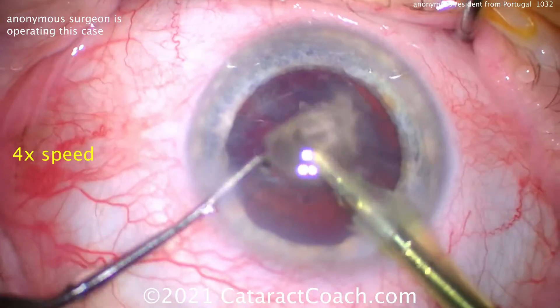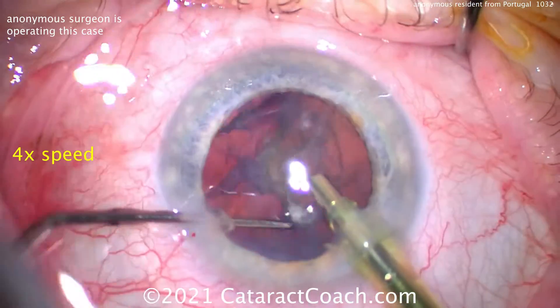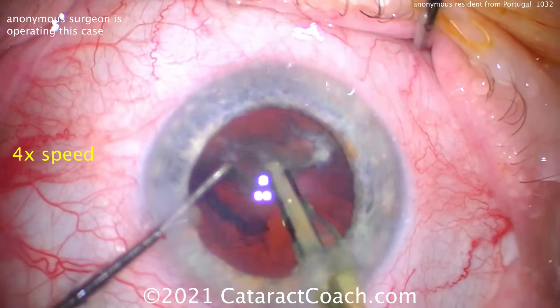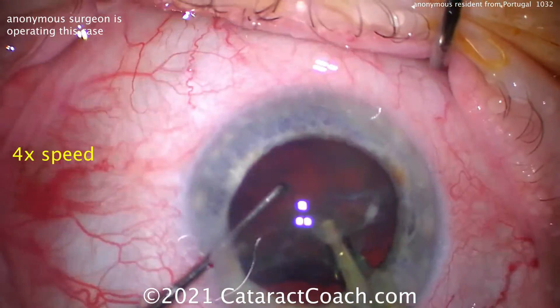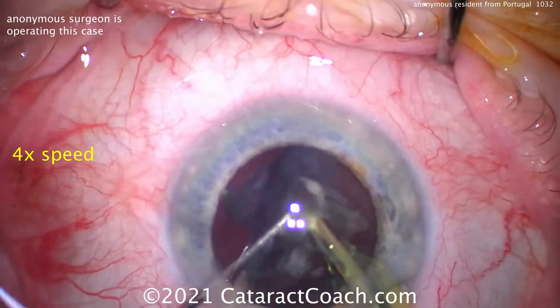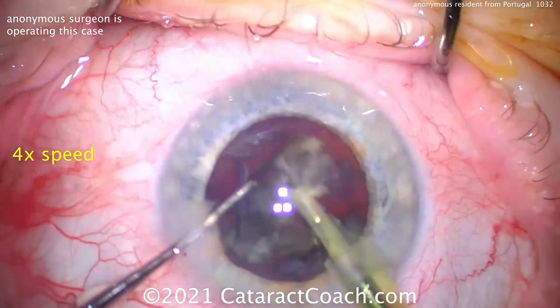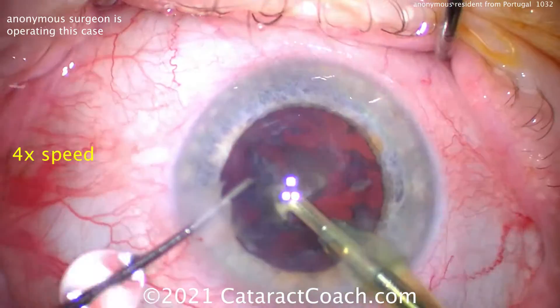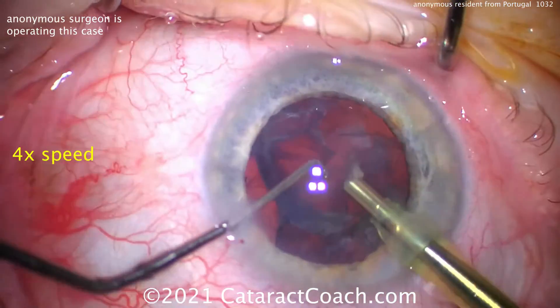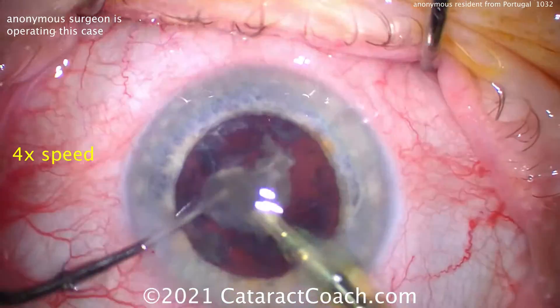That's because this nucleus has sufficient density — it's not that soft of a lens. And when it has that density, you can chop it pretty easily. Let's see the last bit of nucleus here, buzzing in and the chop — and there it is — and we'll take that out. So that's going fine. The last pieces come up nice and easy, right to the tip. And then the epinuclear shell here — very gently bring that up. That looks great. So far, so good.